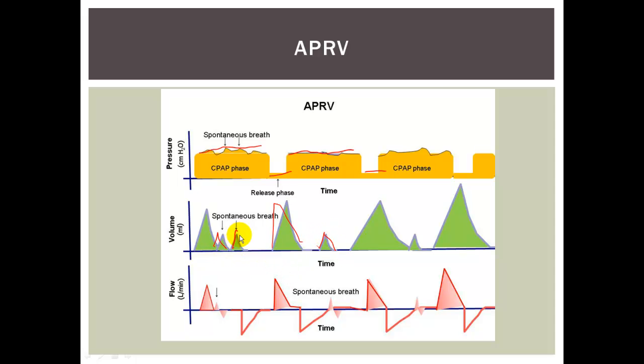Spontaneous breath, spontaneous breath. These are timed. Another spontaneous breath.